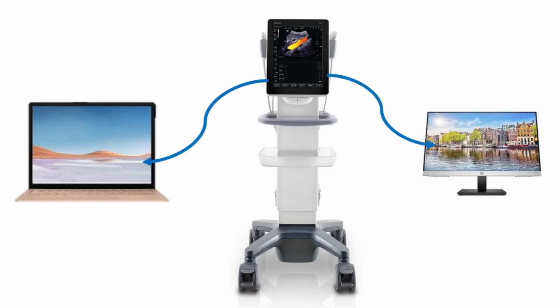The same way that I normally would plug my ultrasound machine into a video monitor when we're teaching, so that everybody around the bedside could actually get a better view of what's on the screen. Unfortunately, you can't just do that. So we had to work around that problem of how can we do this?